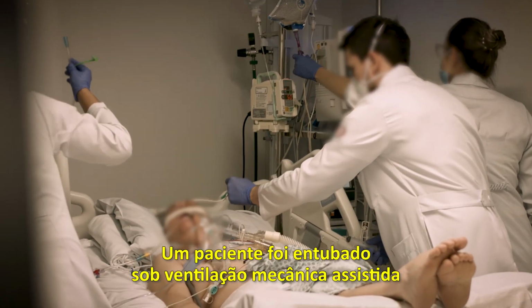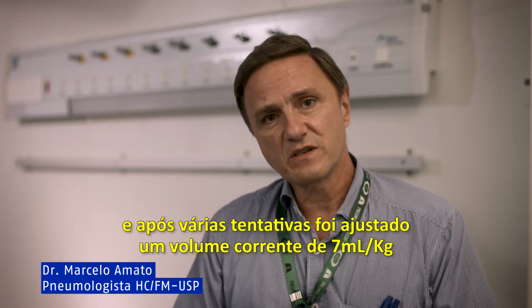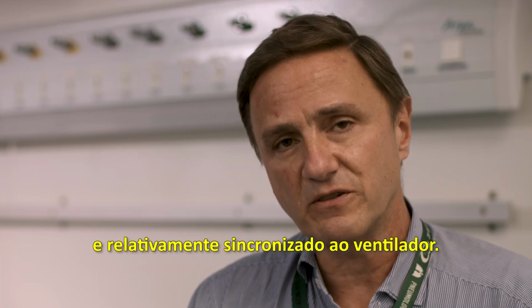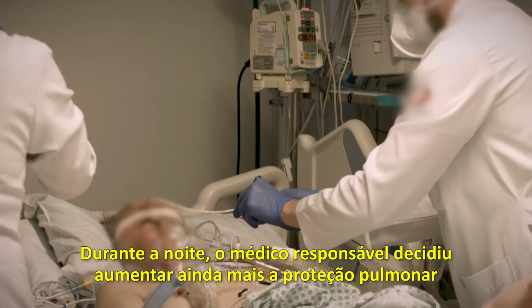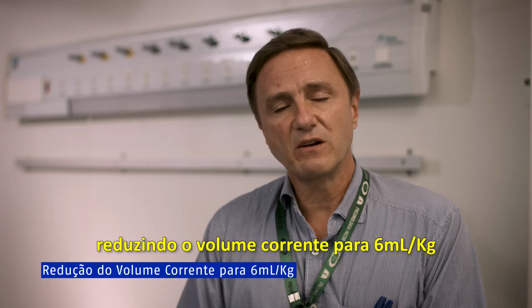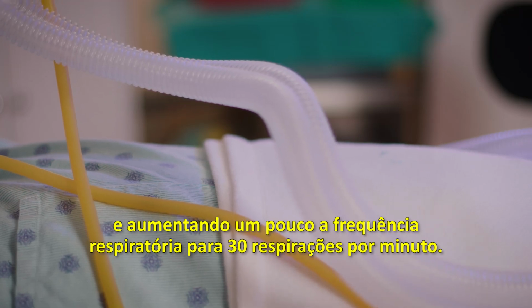The patient was intubated under assisted mechanical ventilation, and after extensive trial and error, he was set at 7 mL per kilogram of tidal volume and relatively synchronized with the ventilator. During the night, the physician in charge of the patient decided to increase further the lung protection, decreasing the tidal volume down to 6 mL per kilogram and increasing the respiratory rate a little bit to 30 breaths per minute.